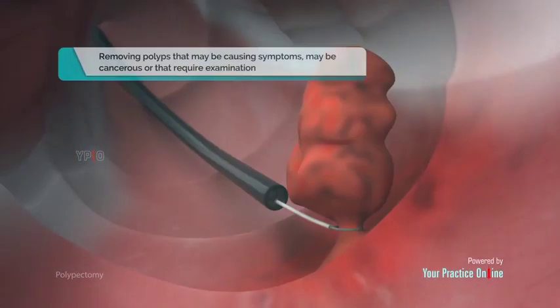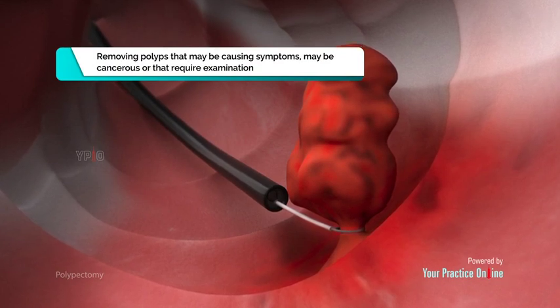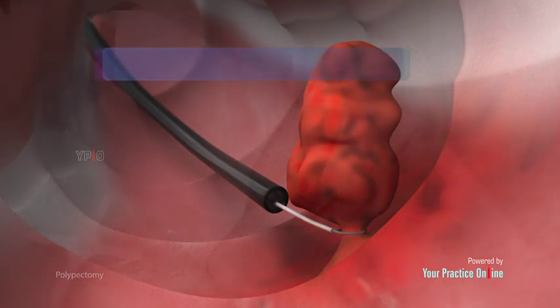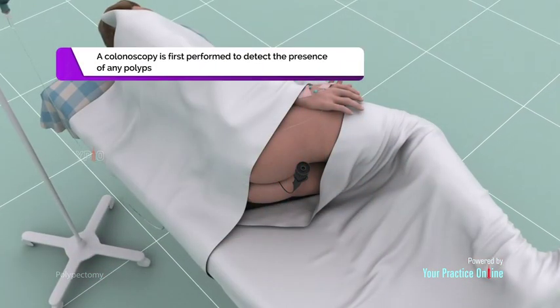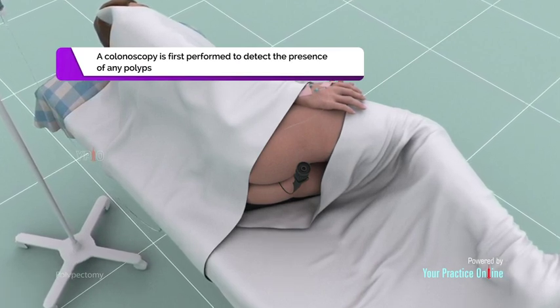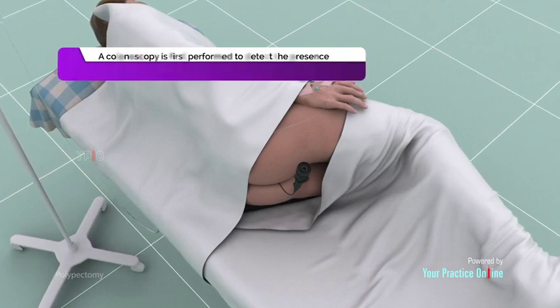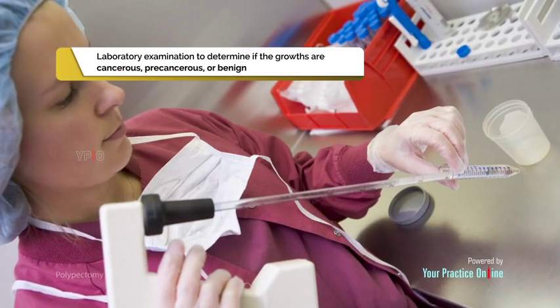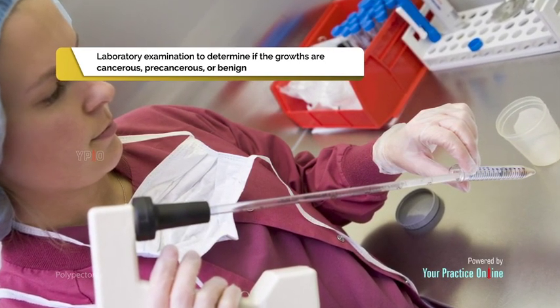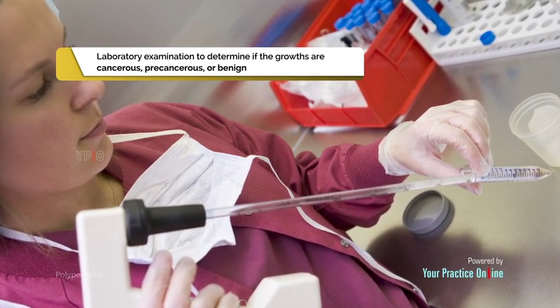Indications. A polypectomy is indicated for removing polyps that may be causing symptoms, may be cancerous, or that require examination. Typically, a colonoscopy is first performed to detect the presence of any polyps. If any are detected, a polypectomy is performed at that time and the abnormal tissue is removed. The tissue is then sent for laboratory examination to determine if the growths are cancerous, precancerous, or benign. Colonoscopies can help to prevent colon cancer through early intervention.